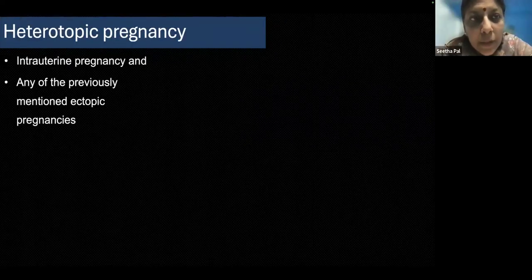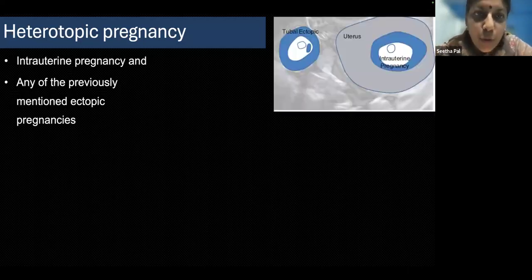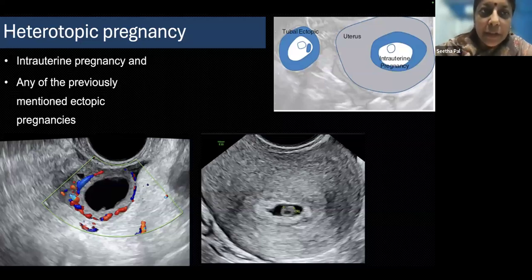Thank you. I would like to comment that when we talk about ectopic pregnancies, the term pseudo-sac also should not be used, because even if it's not an ectopic, people tend to think it might be an ectopic when it might not be. So just call it something like fluid.